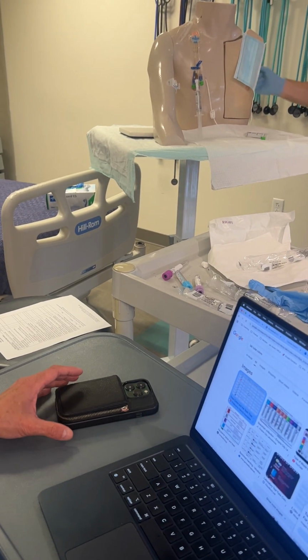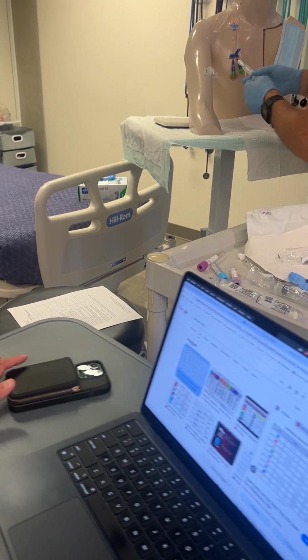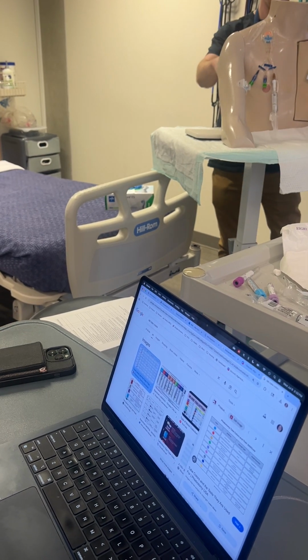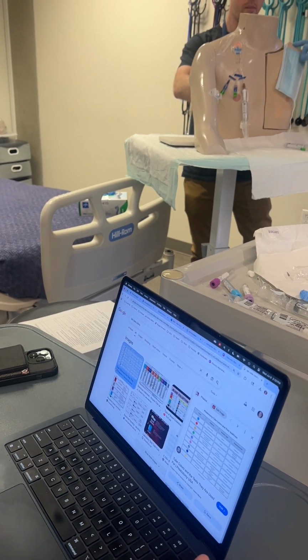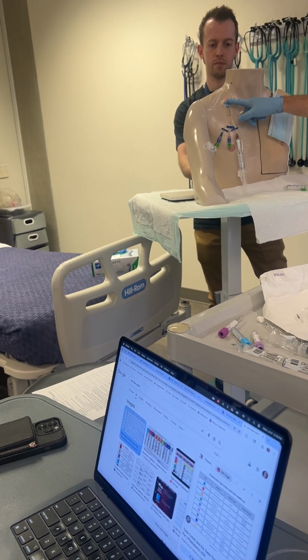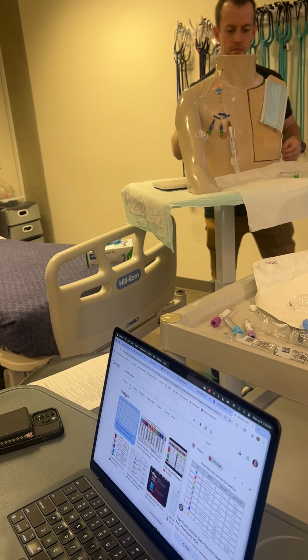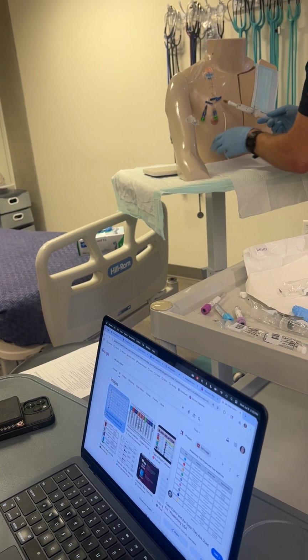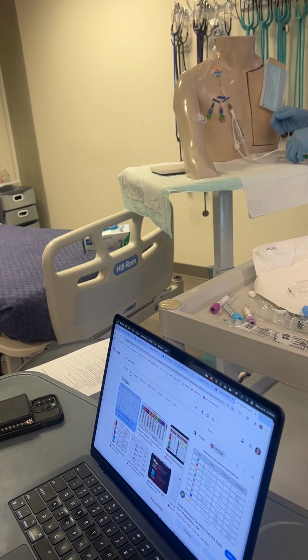Yeah, you should be doing your blood draws from the port cap here. Just on your chest, some of them are set up for the port, some are set for here, so just be cognizant which one you're pushing the blood or the fluid through, because they're not all set up. So we'll just move over to the port, yeah.